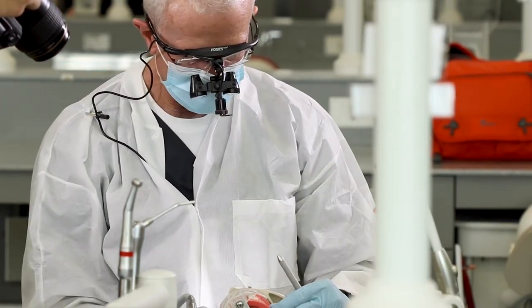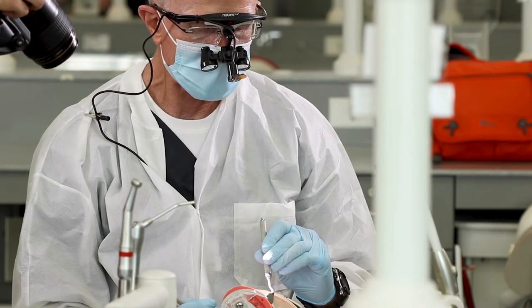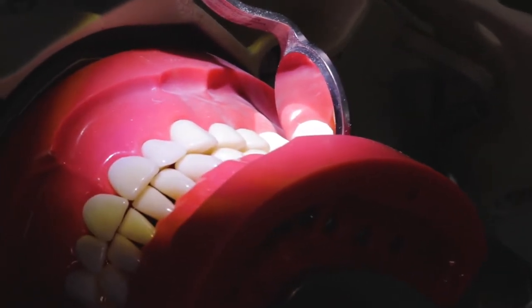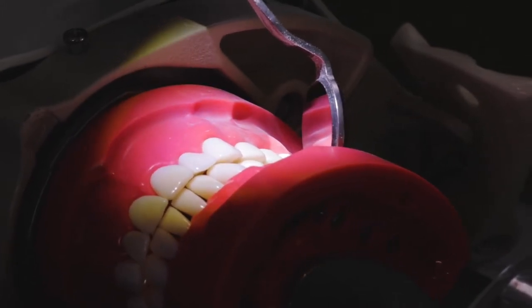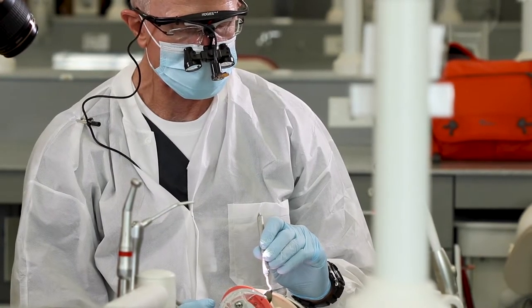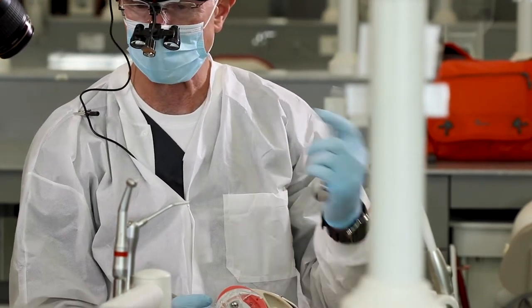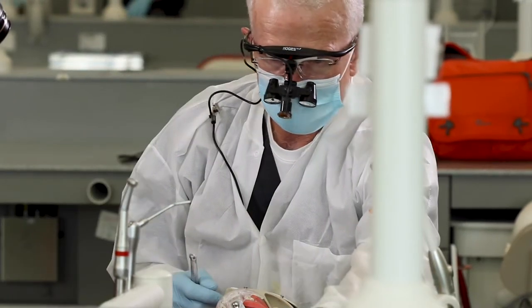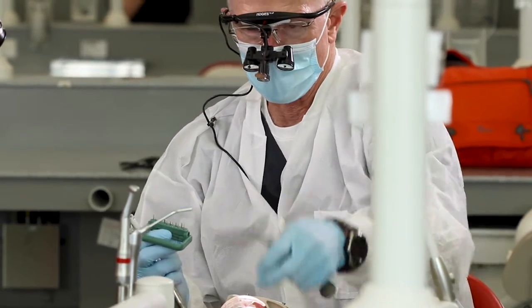So we've done the rough occlusal reduction. At this point we can stop and take a look — I can tell I reduced just about as much on the distal as I did on the mesial, not intending to necessarily, so I'm going to need to keep that in mind as I do my final refinement of the occlusal reduction. I can see there's still a little bit more gap toward the distal. So I'll compensate for that when I move to the diamond — the 6878K 018 diamond — which is what I will do next.